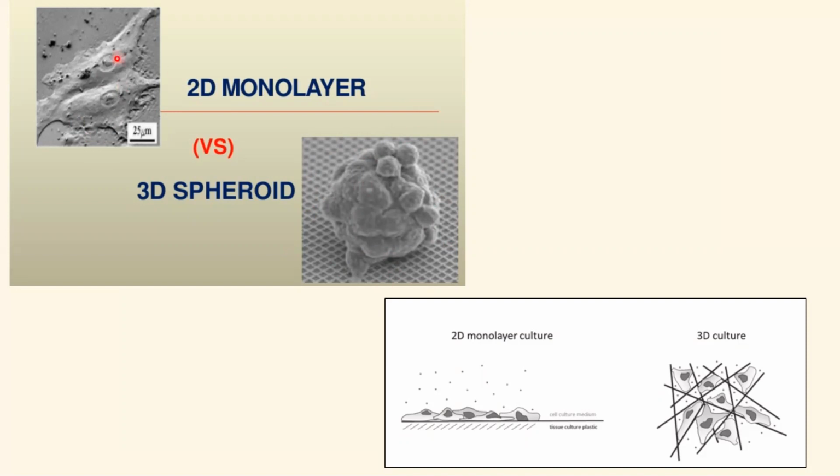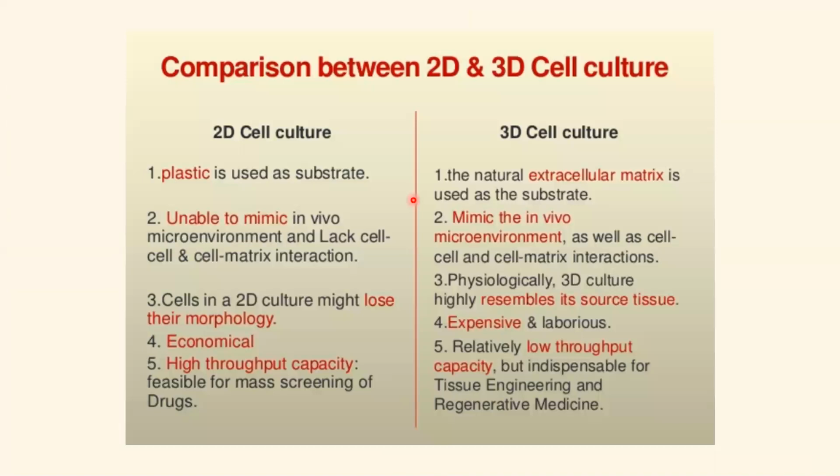So you could see when these cells are in culture, they look stressed. They're not happy like this cell. That's why the new technology is 3D. It's a little more expensive, and you have low throughput capacity, but it's indispensable for tissue engineering and regenerative medicine.